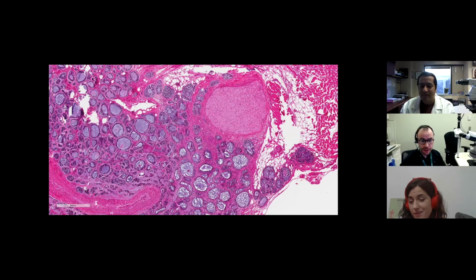So to me, I think there are some areas where you see these kind of more punched out spaces. Some of them are a little bit more challenging because they're a bit larger, right? But I think the architecture of this, and it looks like more of a central lesion. Yeah. There's a nerve with perineural invasion around it, right? Oh, yeah. I haven't seen a normal lung adenocarcinoma looking like that. No. Yes, that's true. It would be very, very unusual to have that kind of look.